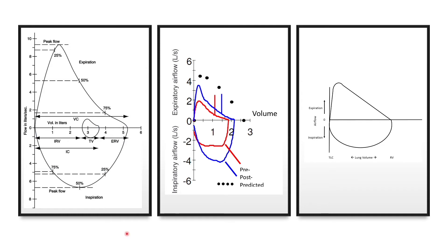In other graphs, like the first two panels here, you'll see that the zero is actually the point that crosses the y-axis, and the numbers turn positive as you go to the right of the graph. This second panel is actually how flow volume loops are represented at our MetroHealth pulmonary function lab. This final panel just doesn't even bother with labels on the x-axis and leaves it blank. So these are also some conventions you might see.